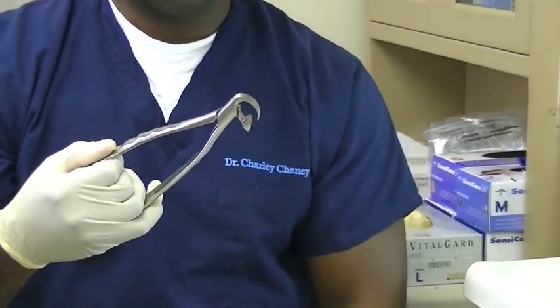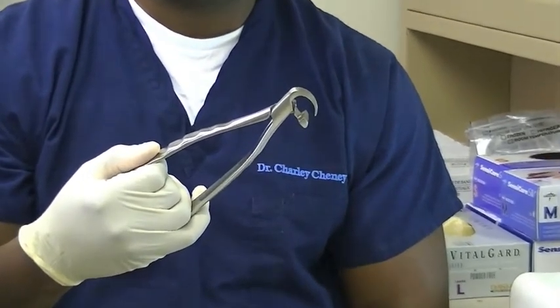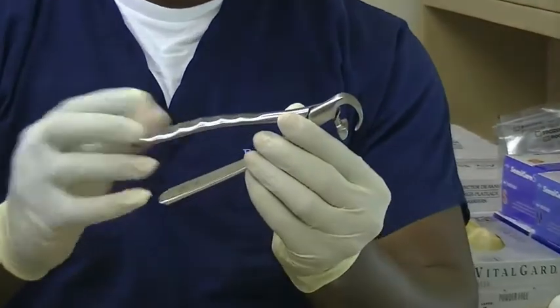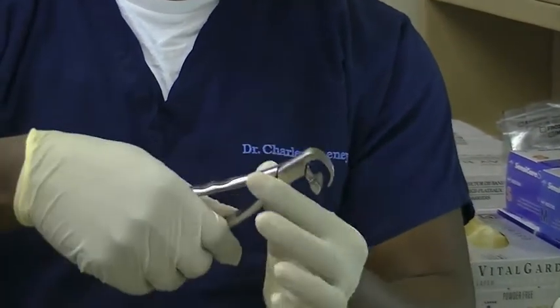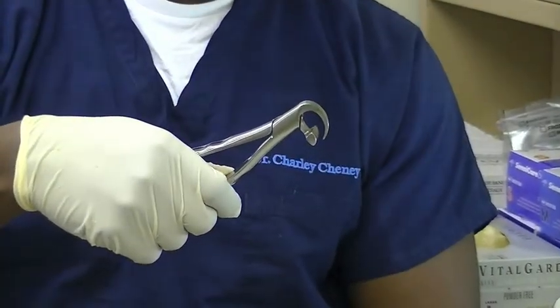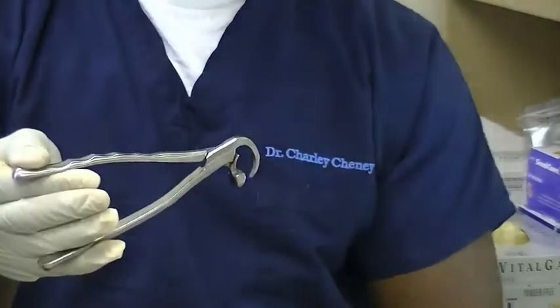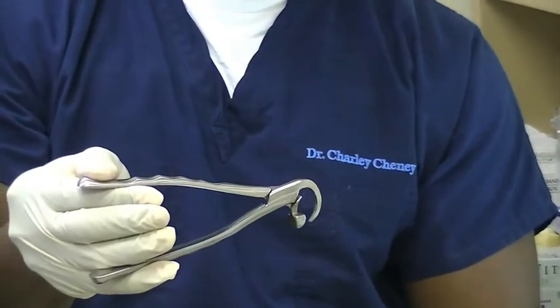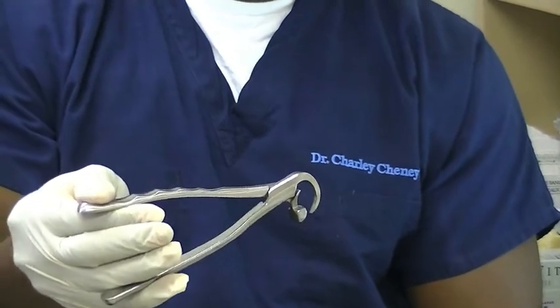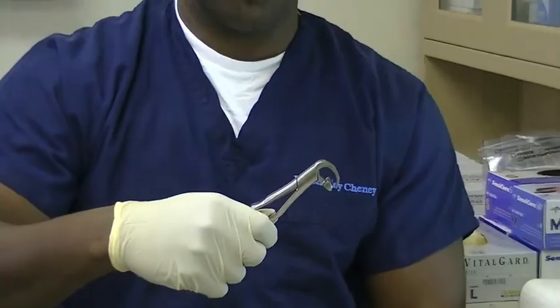The difference between using conventional forceps and the Physics Forceps is the handling of the handles. You're not grasping the handles, clamping down on the forceps. Instead, you're just engaging it and rotating your wrist. The energy comes from the rotation of the wrist and not clamping down on the forceps.